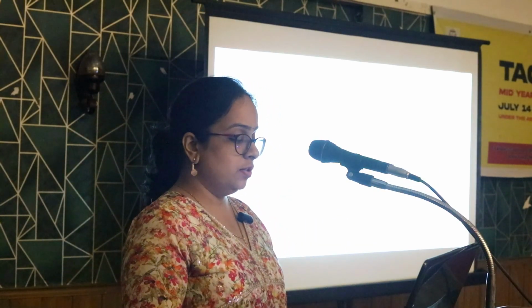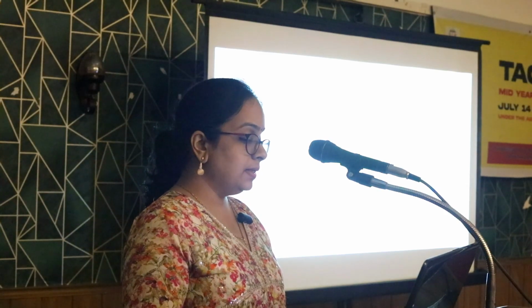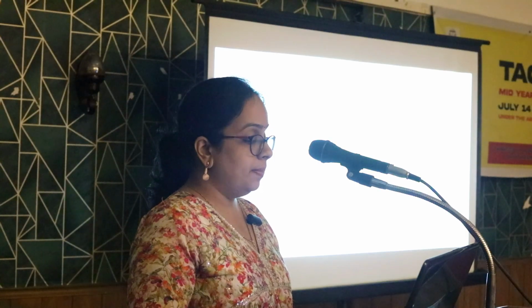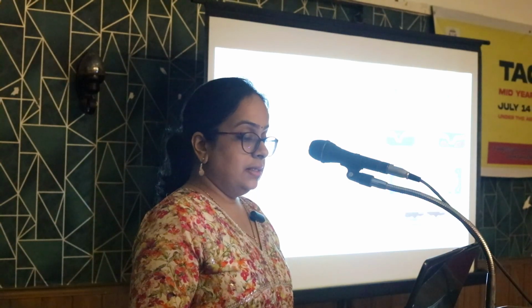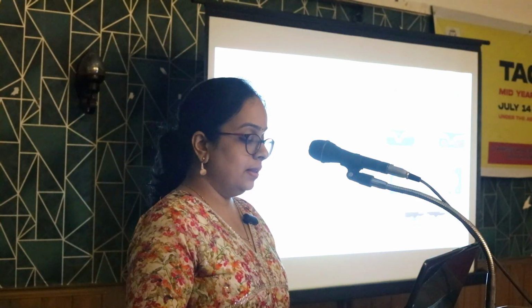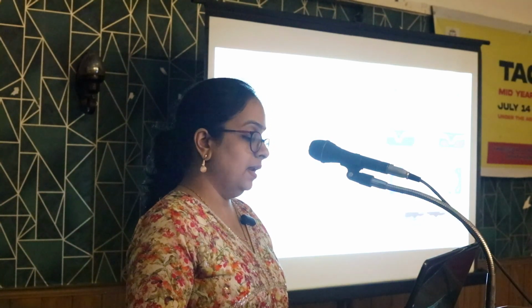Similarly, in this patient, there is only a small RNFL defect, and this is the area where there can be a field defect, and the patient is having a field defect exactly at this area. This patient also is having a thinning in the superior quadrant, and if there is a thinning at that area, these are the two areas where there can be a field defect, and the patient is starting to have a field defect in this area.